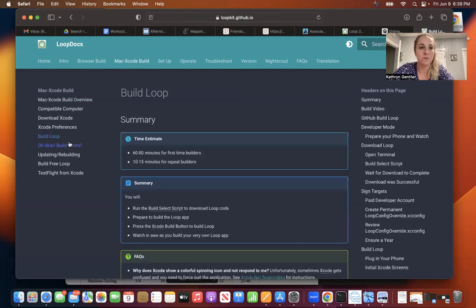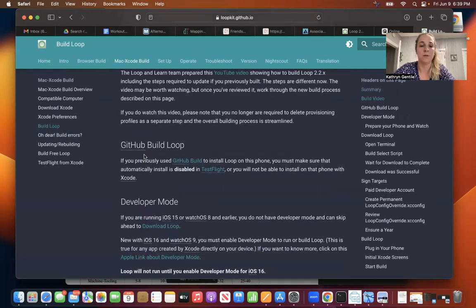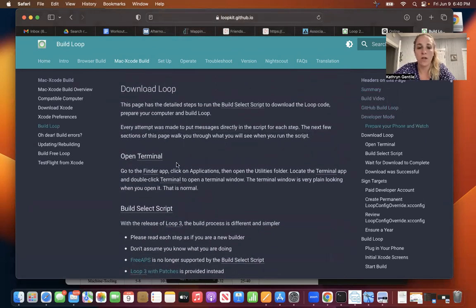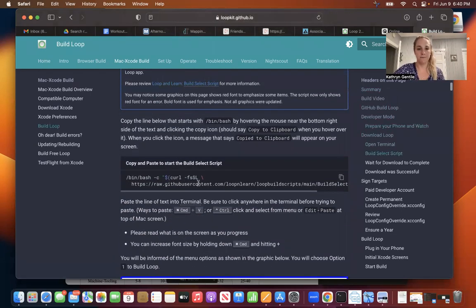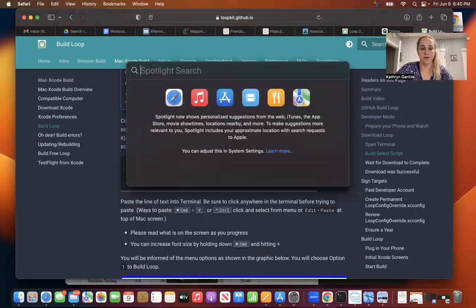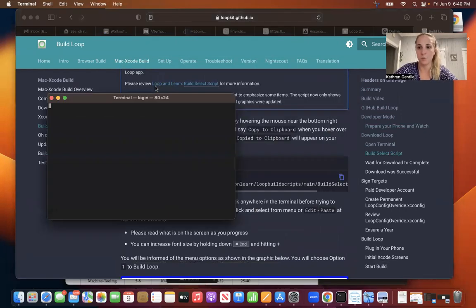Now, for the purpose of this video, I'm going to skip straight to build loop. And I am going to scroll and find the code. So here it is. I'm going to copy and paste this. And then we are going to search terminal. And then sometimes it'll say in here that you need to do an update. When it says that, you just have to copy and paste what is already in there, and it'll do that update for what you need to do.